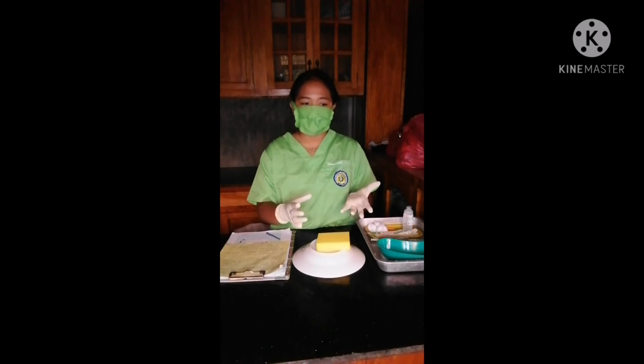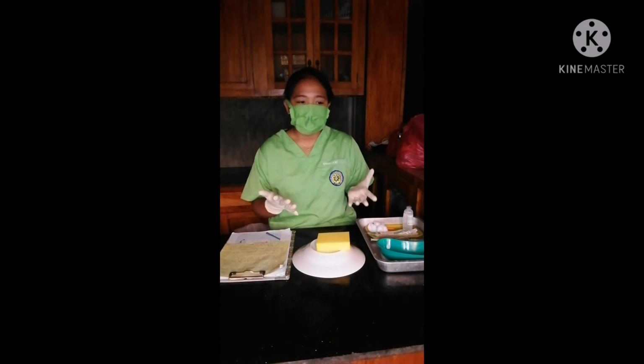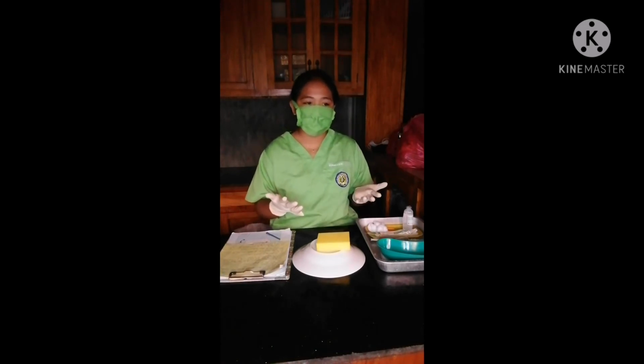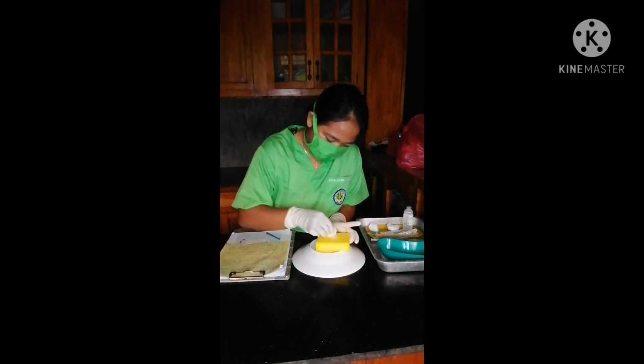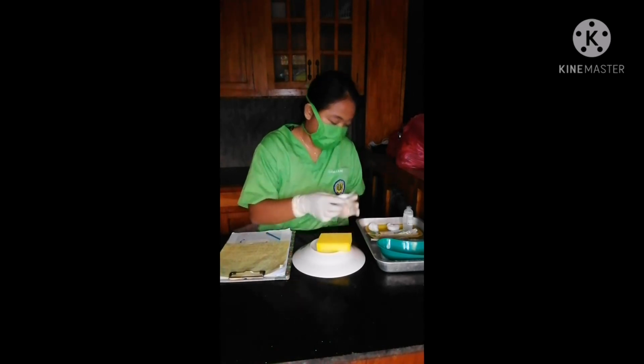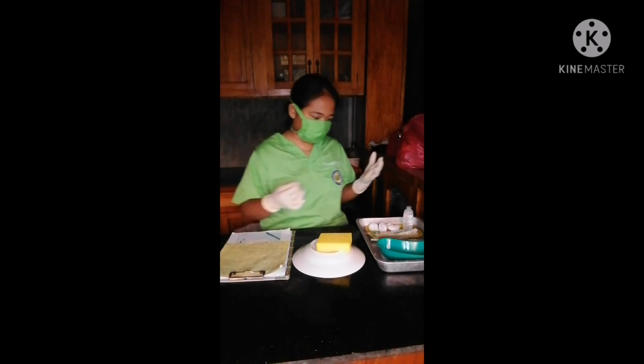Identify the appropriate landmarks for the site chosen. Clean the site with an antibacterial, antimicrobial swab, wiping with a firm circular motion and moving outward from the injection site. Allow the skin to dry. Remove the needle cap with the non-dominant hand by pulling it straight off.